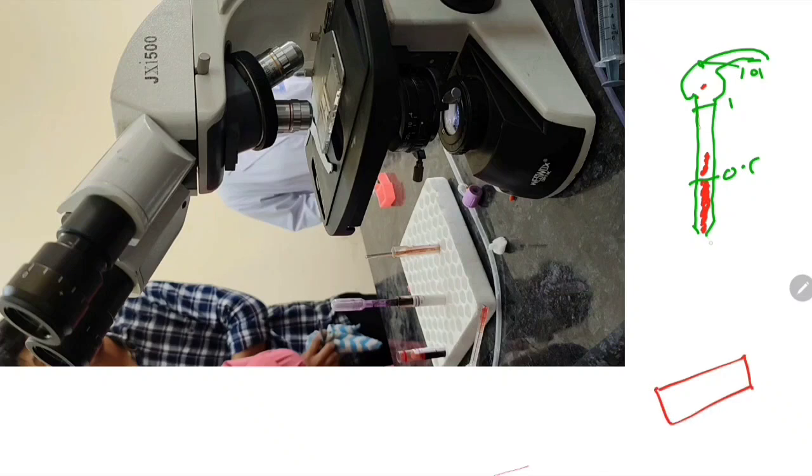We should not put cotton. If you put cotton on the tip, only the fluid part will come out and the cells will remain there, and your count will be higher, because any absorbent material will take out only the fluid part from this blood. So the final volume we will see, okay, 0.5 is there, but only the fluid part will come out with the cotton. So we should not use cotton at the tip to take out the extra blood.